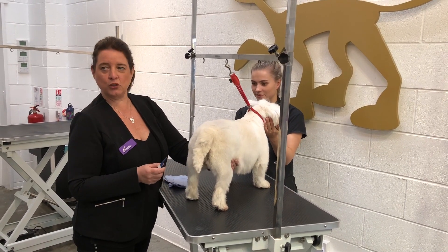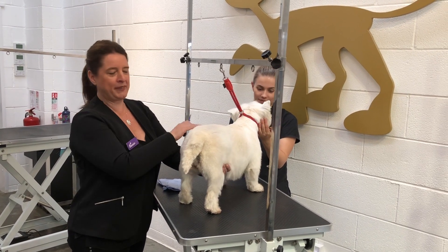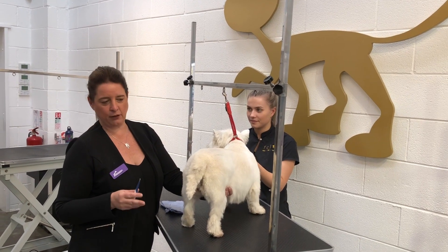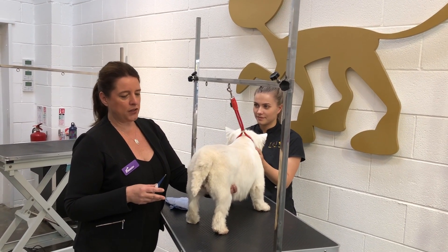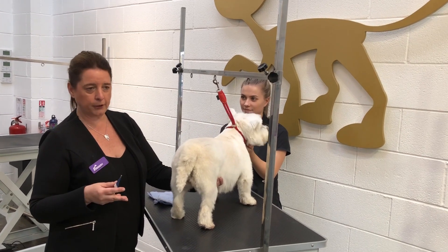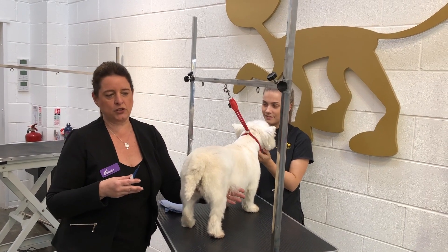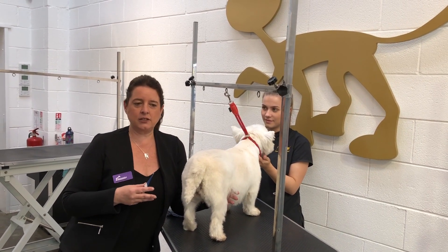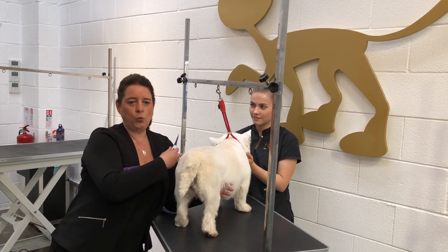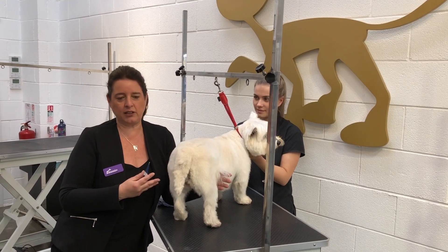Welcome everybody. I'm just about to do a tutorial. Chesterfield very kindly lent me their dog and their thermometer, and I'm about to do a tutorial about taking the vital signs of healthy dogs. One of the things you need to be able to demonstrate if you're working towards your Level 3 diploma is that you're able to do the vital signs, which is quite important as dog groomers.